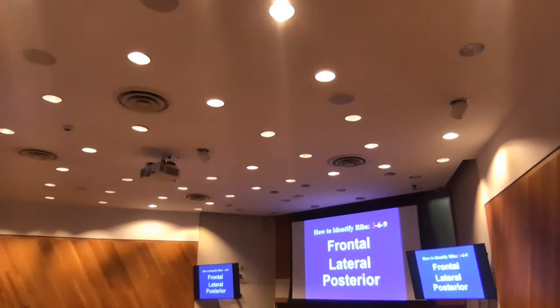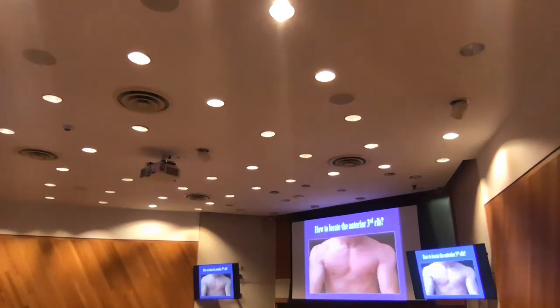We're going to look from the front. Look from the side, right and left, and from the back. Remember, we are trying to make you a clinician, an observer, and a person who will assess the patient before looking at the X-ray. Here again, looking from the front. Where is that zero? Everybody can agree, you put your finger on the wrong one. That will happen. Suprasternal fossa, suprasternal depression. It is above the sternum. What is the name of the breastbone? Sternum, suprasternal, above the sternum. Okay, feel free to locate it. Suprasternal notch. Alright?